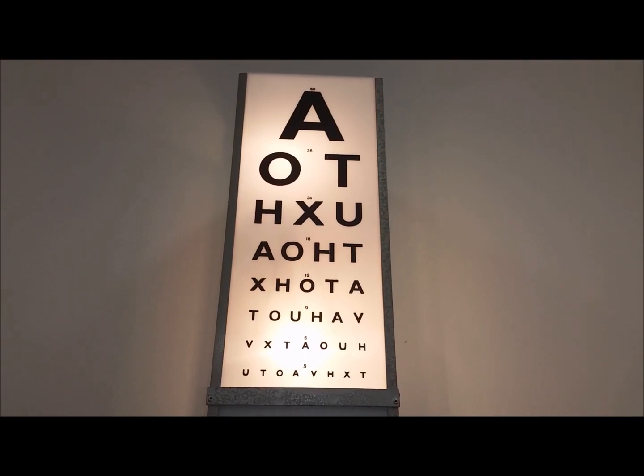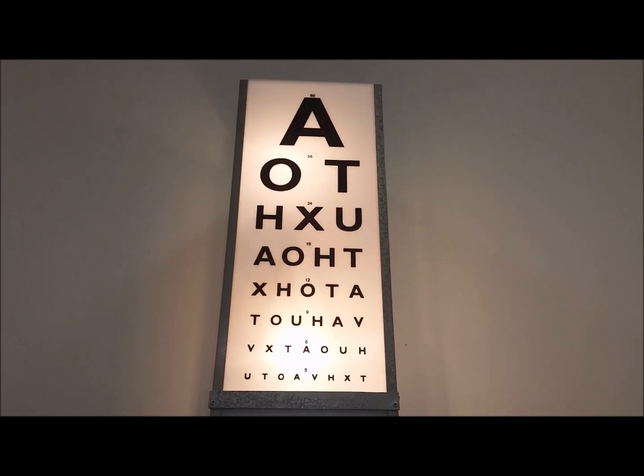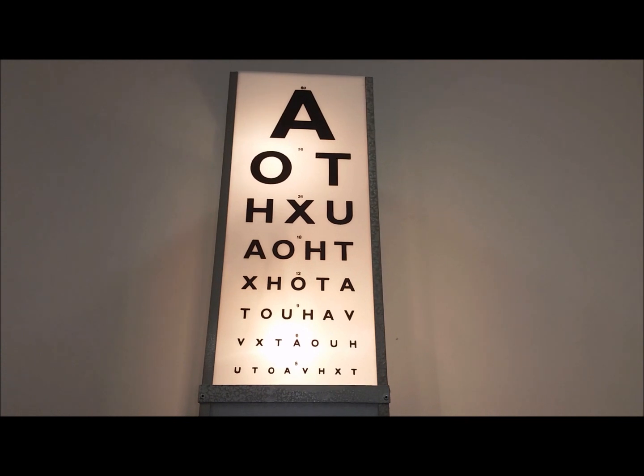The orthoptist begins with testing the patient's visual acuity in their right eye. Okay, Hongbin, I'm just going to get you to look up on the chart for me then, read down to the lowest line you can read. A. Yeah, can you get down any further? No, I can't. In this case, the patient's visual acuity without correction in the right eye is 6/60.